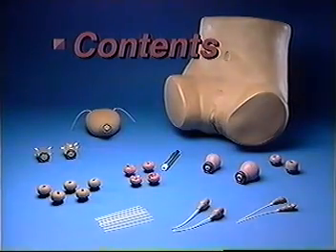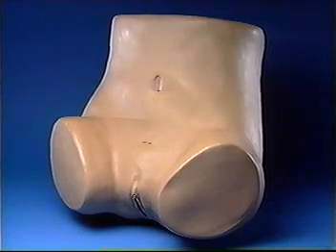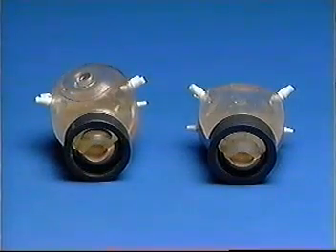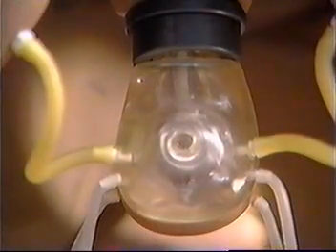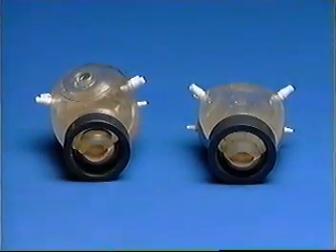Contents. The contents of your ZOE kit are one adult female lower torso with reinforced incisions above the symphysis pubis and below the umbilicus, two normal uteri — one anteverted and one retroverted. These uteri have clear tops to allow you to fully demonstrate procedures such as IUD insertion and uterine sounding. White plastic pegs allow you to attach round and ovarian ligaments and fallopian tubes.